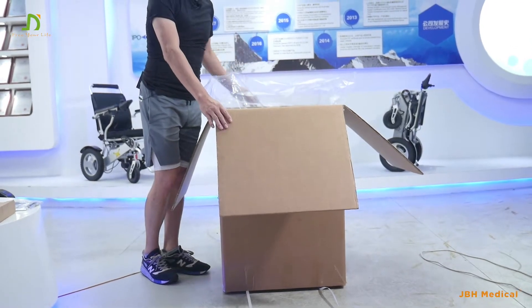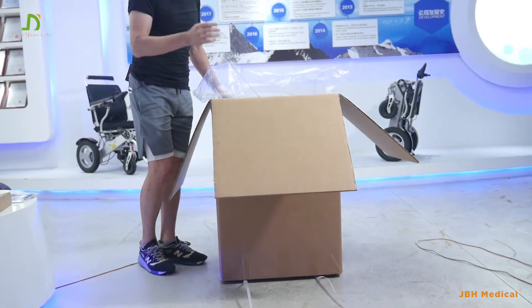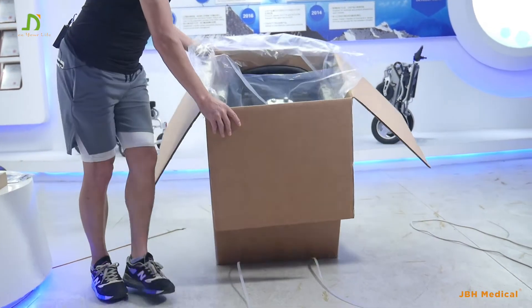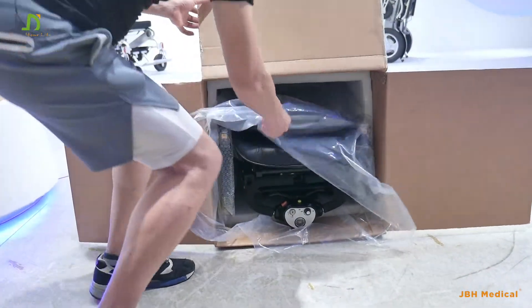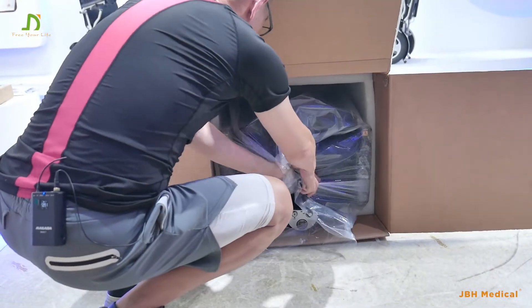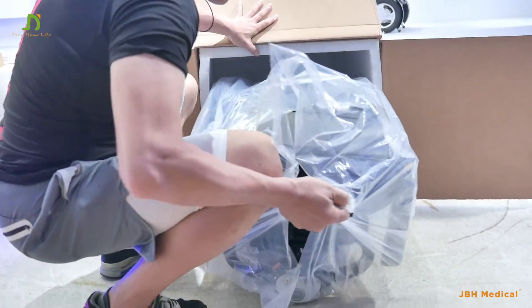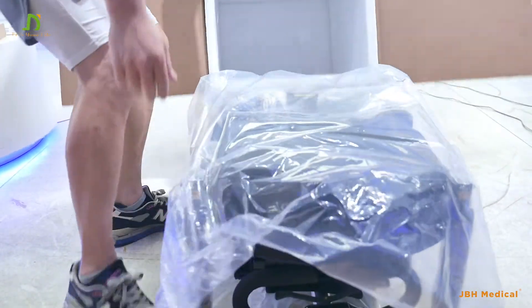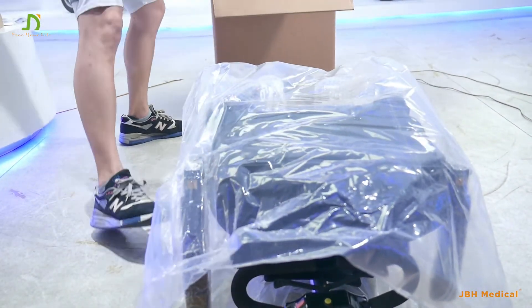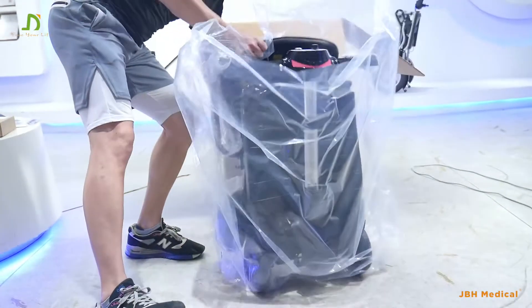Actually, we can have two people for opening the box, but right now I've got only one — it's also very easy. Let's put it down here, the plastic here, pull out the unit and make the unit right up here.